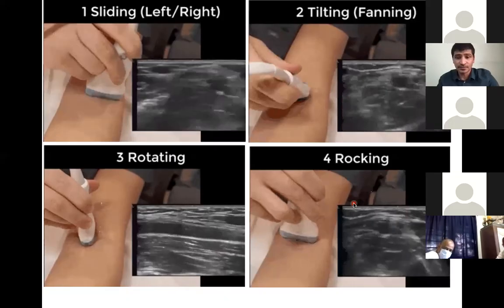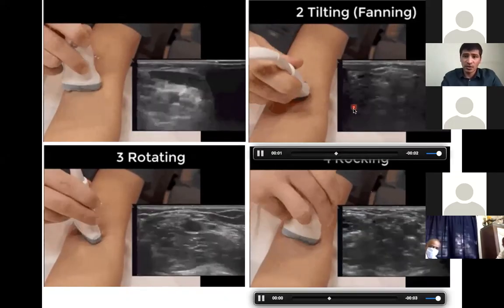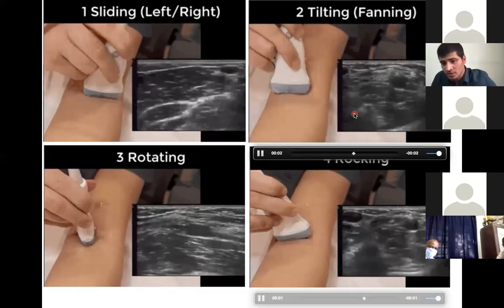And another is rocking. It's also the same. This one and this one are the same, but at a different angle. So it's just a name given to the different motions.